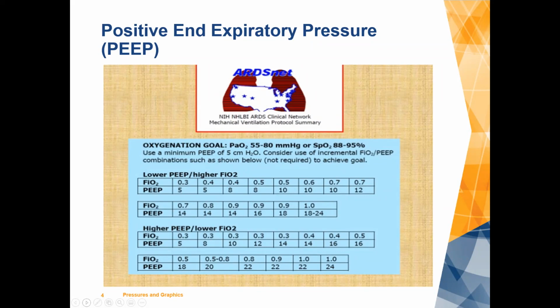Further, if you're not using some of the tools that are available, a few of which we'll go over today, that can help guide the appropriate use of PEEP, then you probably should be. It's something that you actually want to look into, and this presentation will help arm you to be better equipped to do that.